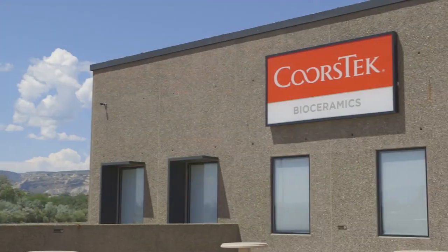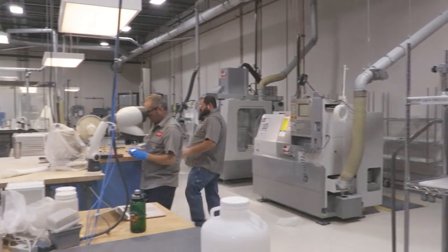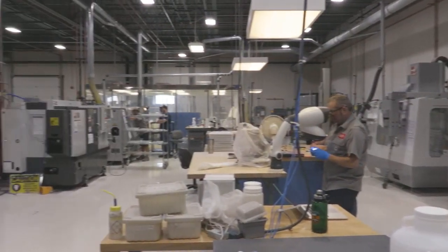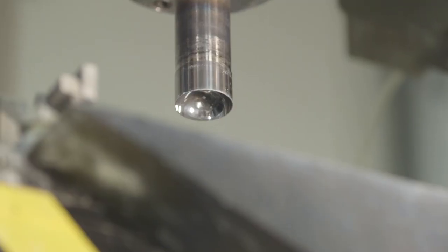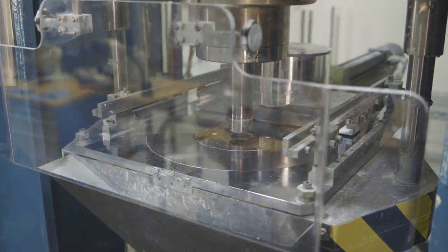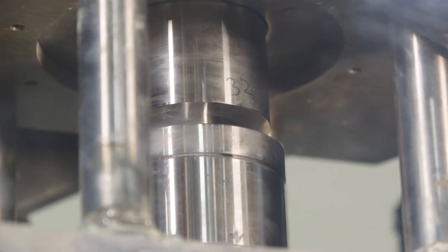At the CoorsTek Bioceramics Facility in Grand Junction, Colorado, USA, the ceramic femoral head begins to take form as the engineered powder is pressed into shape by a dry press. The powder is loaded into the base of the press, properly measured for each part, and pressed into shape with two large pistons.